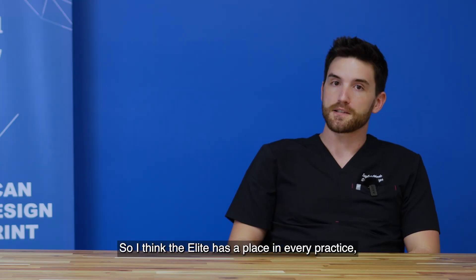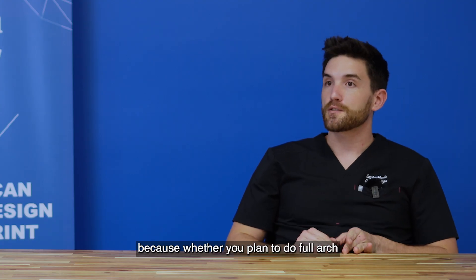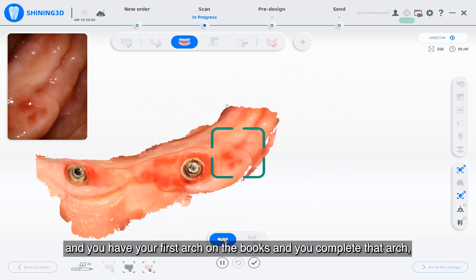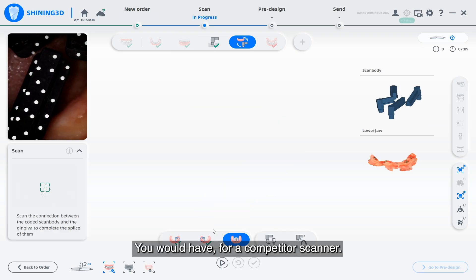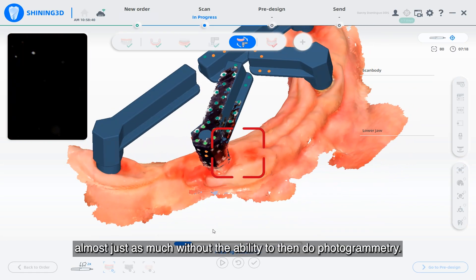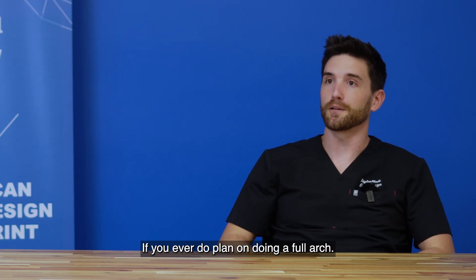I think the Elite has a place in every practice. Whether you plan to do full arch and you have your first arch on the books and you complete that arch, with the price of the Elite it's going to pay for itself. For a competitor scanner, you would have paid almost just as much without the ability to do photogrammetry if you ever plan on doing a full arch.